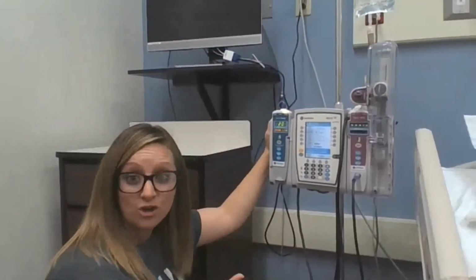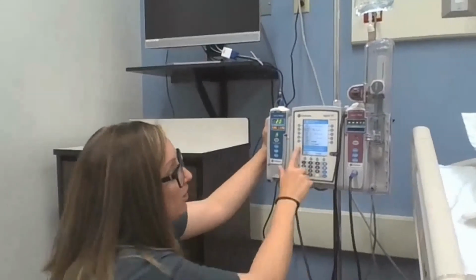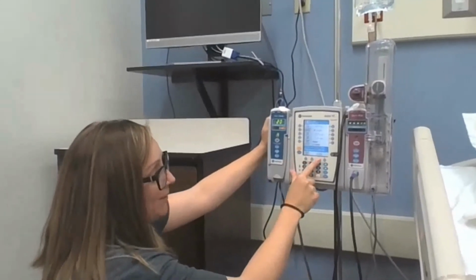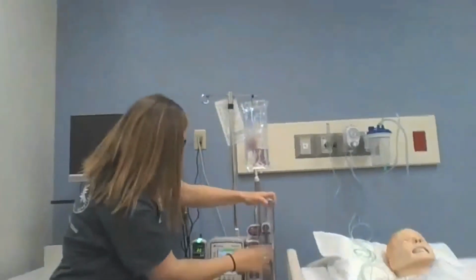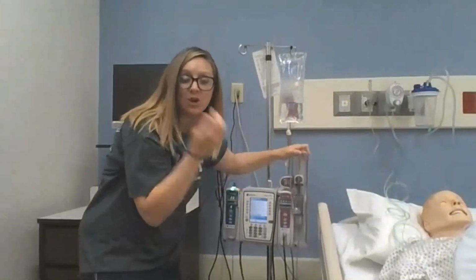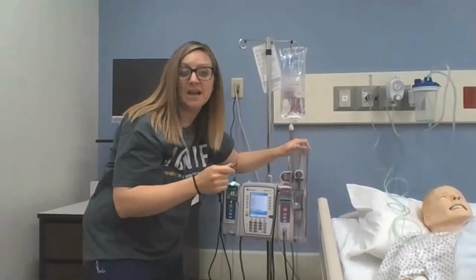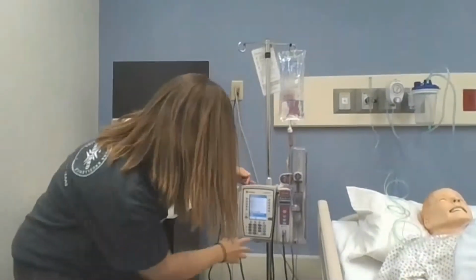So you would check your orders to see if you have a loading dose. In this circumstance, per my orders, I don't have one. So I'm going to hit none. And then I'm going to hit confirm, and it says close and lock the door. So I'm going to come here, lock it, and then take out your key. Don't leave your key in there. If you leave it in, the patients can turn it to program and take their own dose. We don't want that to happen.